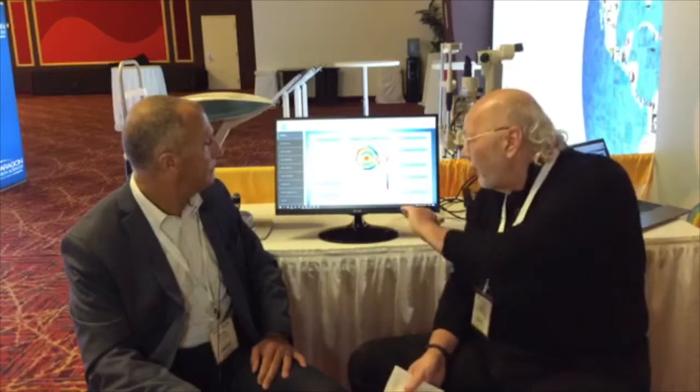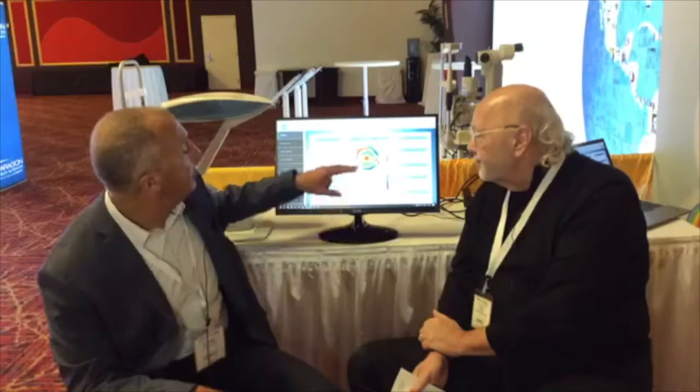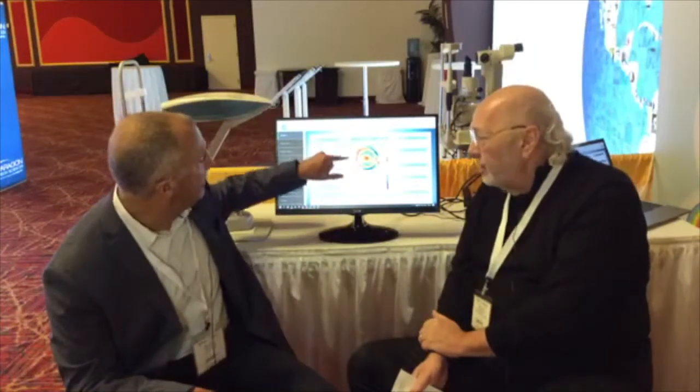And then, of course, here we can actually see what the shape of the eye is. Correct. And I'm able to do that in any meridian right now. We're at the 180. I can take this line, spin it around, you will see that change and measure on those. Do you typically do that to just get an overall idea of what's going on? Correct. I will do that. There's also a 3D image that is really what we're trying to do. We're going to mold a lens right to that. The labs now, I can send this information and they can pretty much mold that lens exactly to fit like a saddle on a horse. Right. And really fit there, exactly.